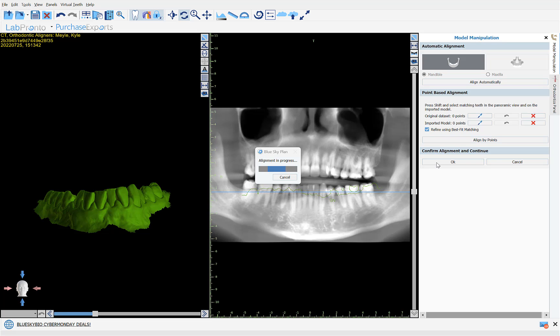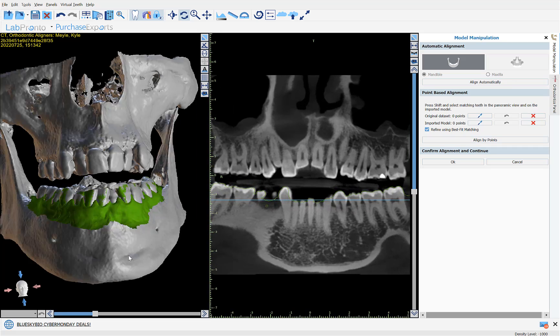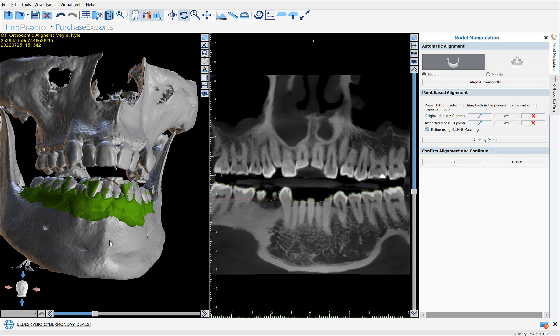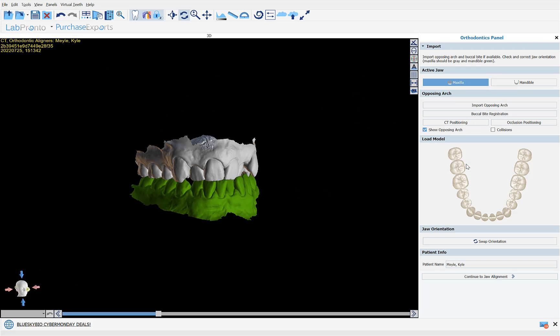The software will proceed to run the alignment on the second jaw. We can once again see in our 2D and 3D views that the software has successfully aligned the STL model to the CT scan. If there was a problem, we could use our point functionality to identify several unique points in the CT scan and the STL model scan to help the software do the alignment. I'm going to click OK to continue.